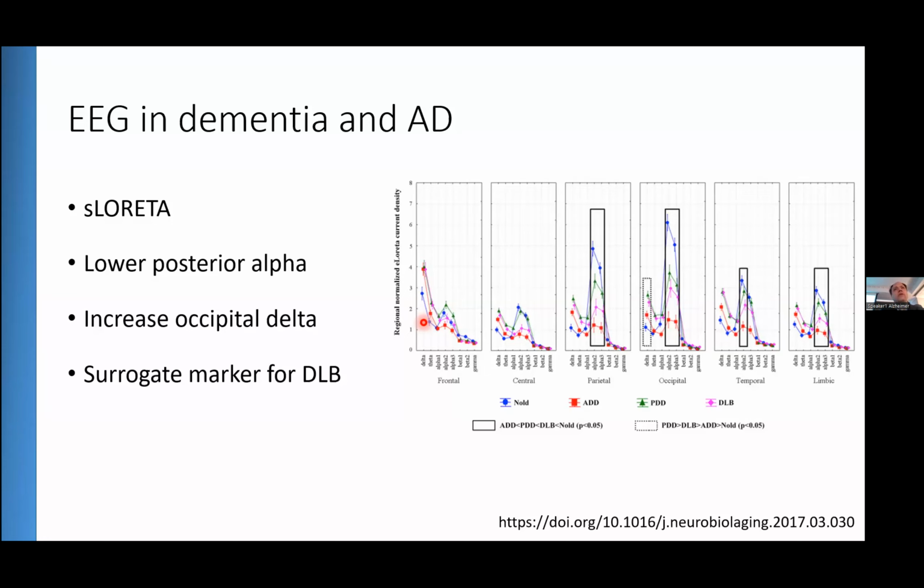It is not enough that we just say by visual inspection, oh, I think there's more delta or theta than alpha. And one of those tools is sLORETA. This is the low resolution electromagnetic tomography. It is a mathematical process in the program where we can calculate and improve our source localization based on certain parameters, but it also depends on the number of electrodes.